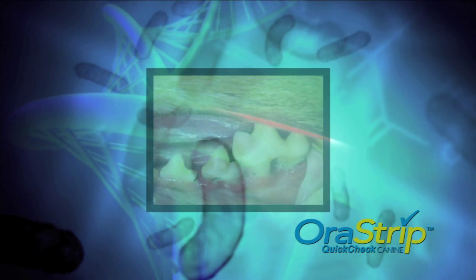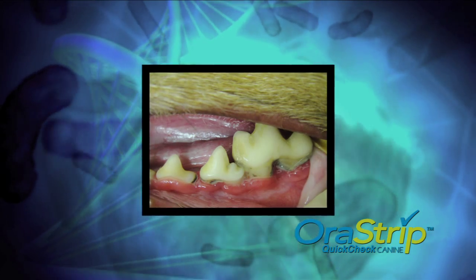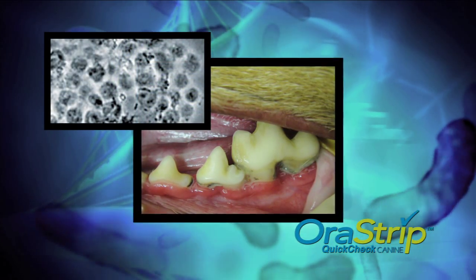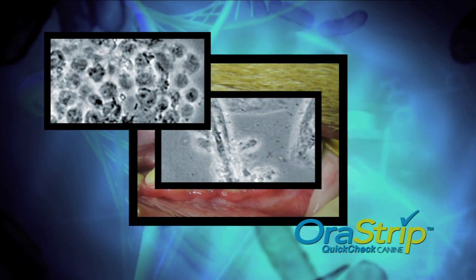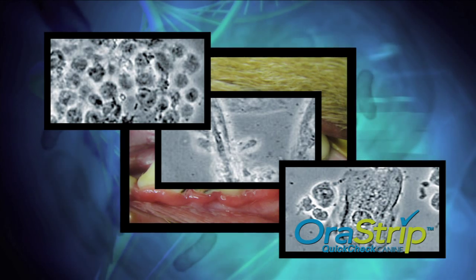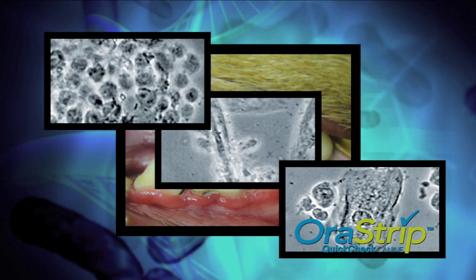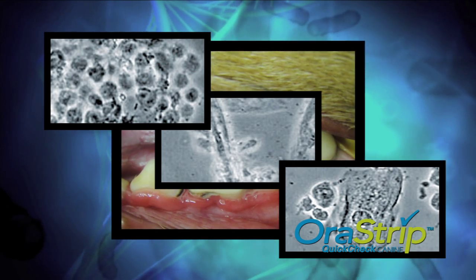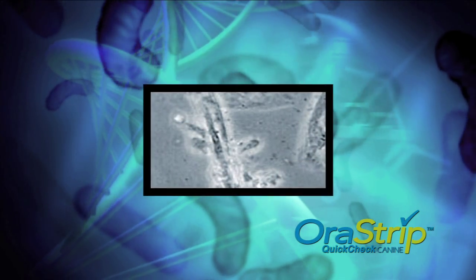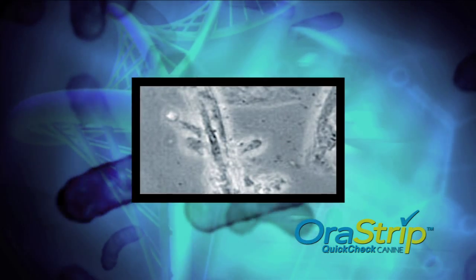Periodontal disease is an active infection of the gums caused by anaerobic bacteria. These bacteria produce metabolic products called thiols that can disrupt gum tissue and induce bone loss. OraStrip Quick Check detects and monitors periodontal disease activity by measuring the extent of periodontal infection, by directly measuring the concentration of thiols from the gingival margin.